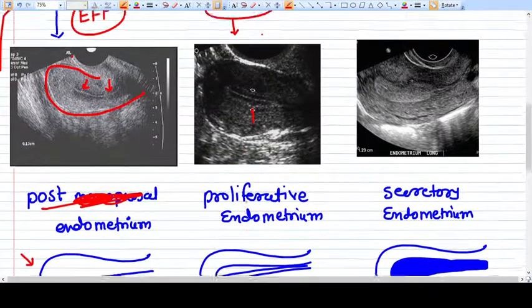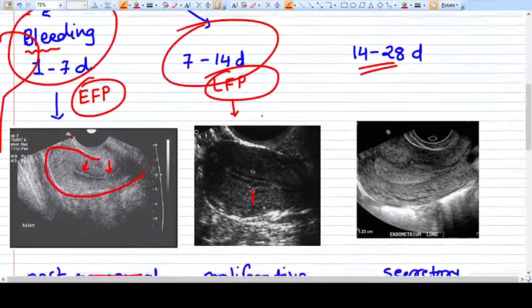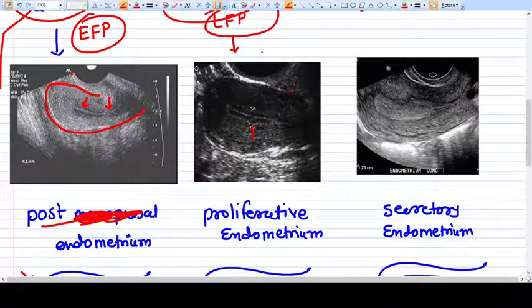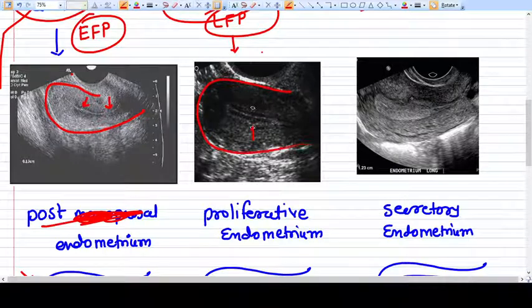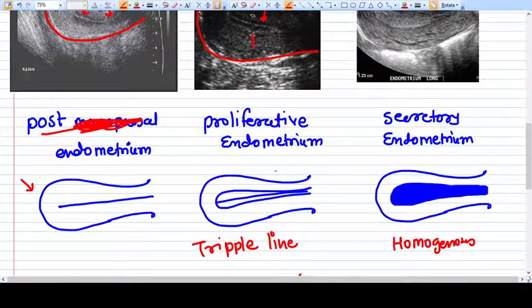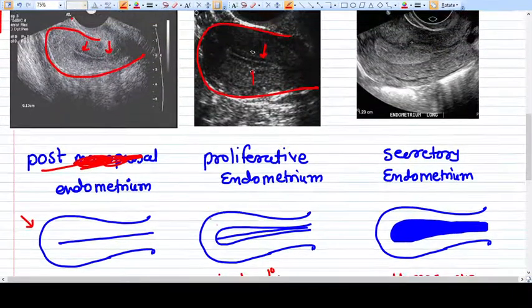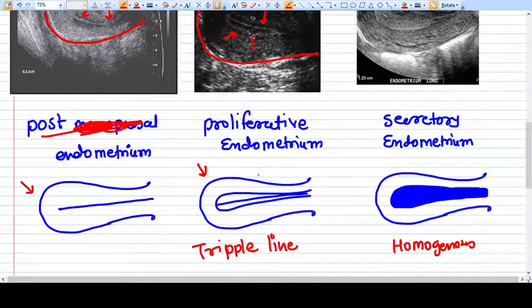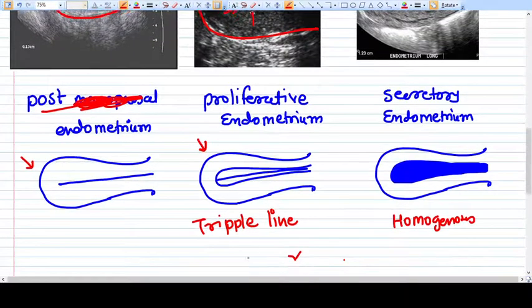In the proliferative phase, from day 7 to day 14, endometrial proliferation happens. As you can see here, it becomes a triple line endometrium. I have shown a graphical picture and also a real ultrasound picture — this triple line endometrium is the proliferative endometrium seen at the peak of the follicular phase.